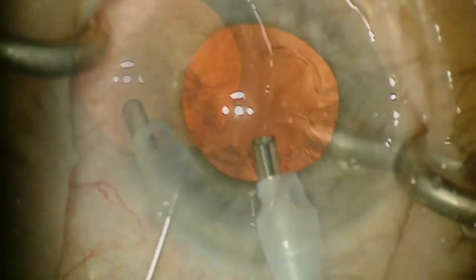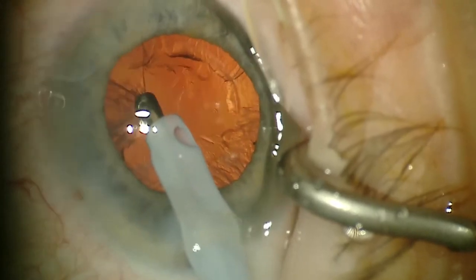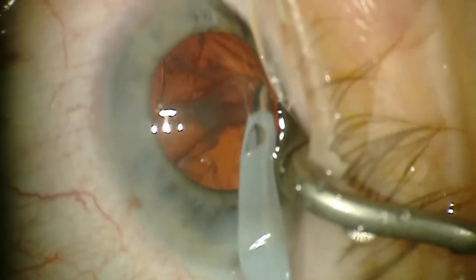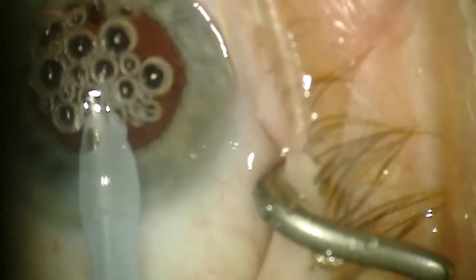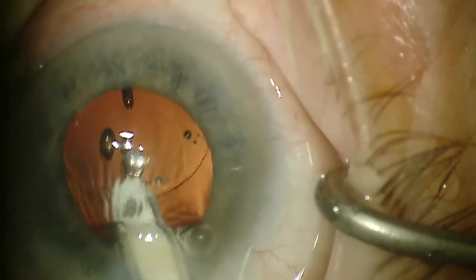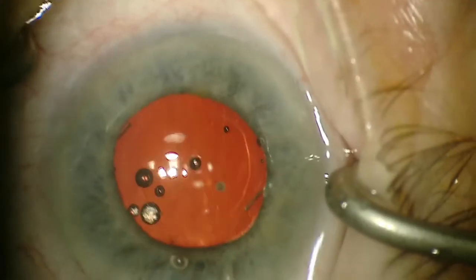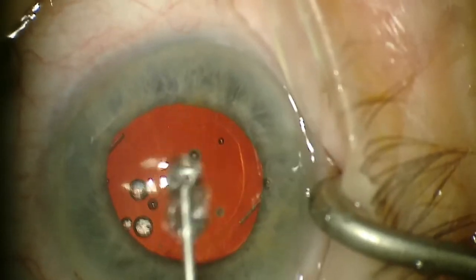After I've done the FACO, just do a little IA for what's remaining. We're using a metal IA tip instead of the polymer. Then we switch over from IA to place the lens. This is a LI61AO soft acrylic lens. It has a nice injector system where you can get it straight in the bag. Then you need to fill the angle with some viscoelastic to deepen it and put some on the top part of the eye.